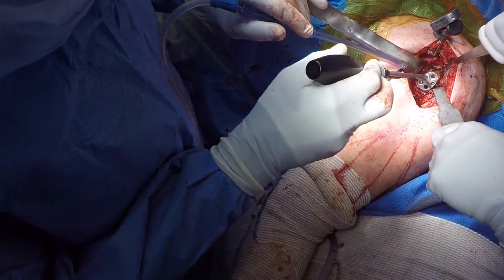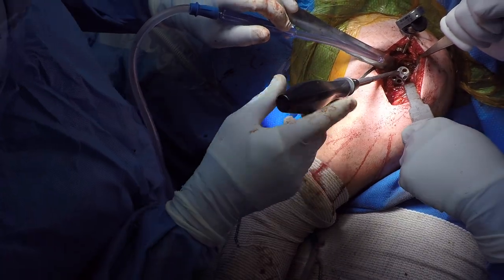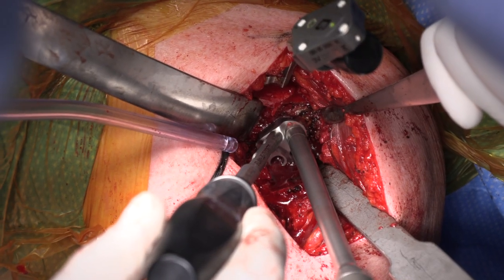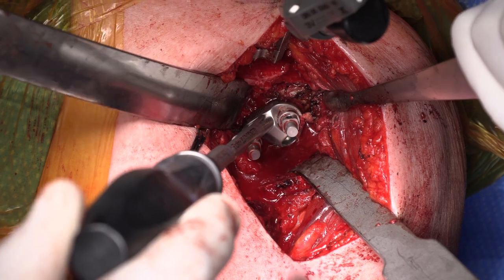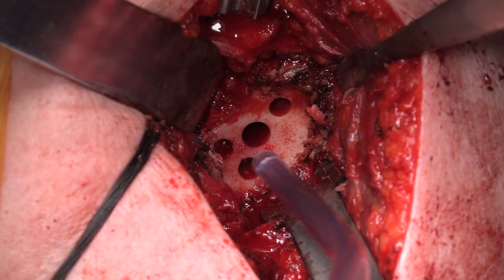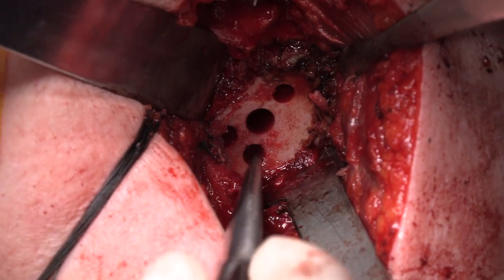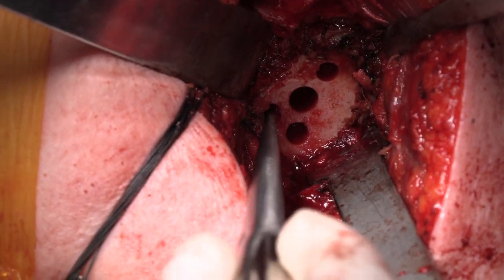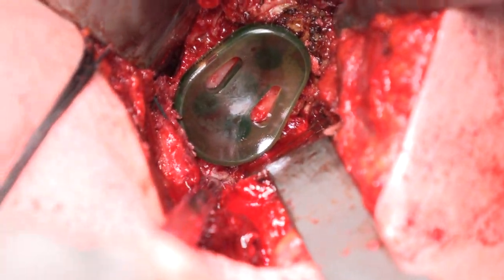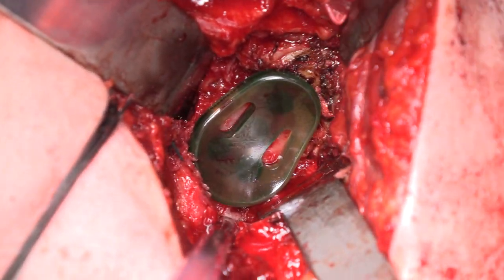The second guide with the central peg is then inserted. The superior hole is drilled and a peg is inserted to control rotation, followed by the anterior inferior hole and the posterior inferior hole. The guide is then removed. The trial component is used to confirm the size and position, and in this case the medium-sized glenoid was chosen.